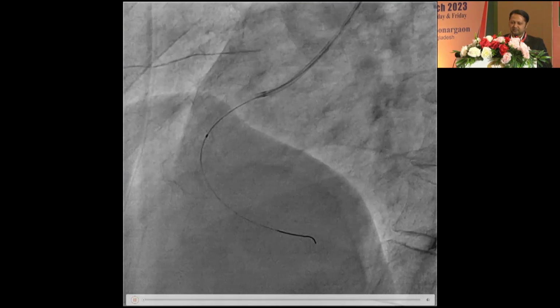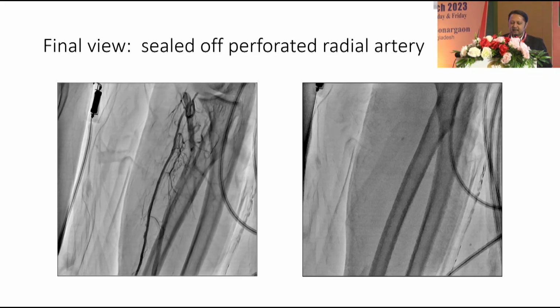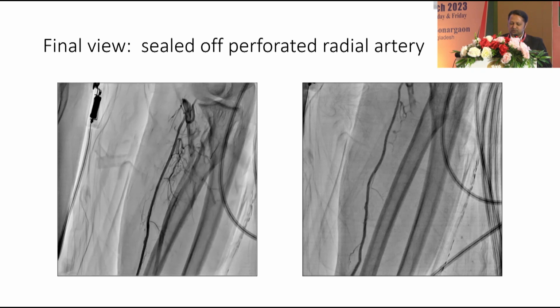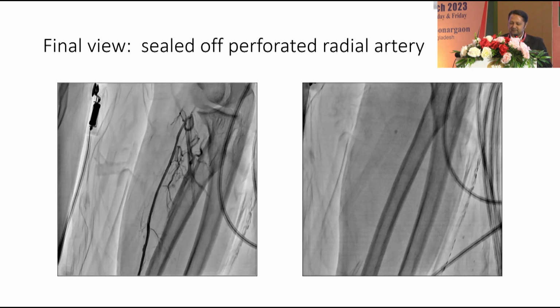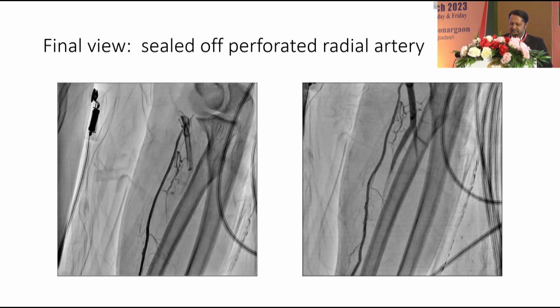Then we completed the procedure, and we checked after procedure completion: there is sealing of the perforated radial artery. This is the final result.